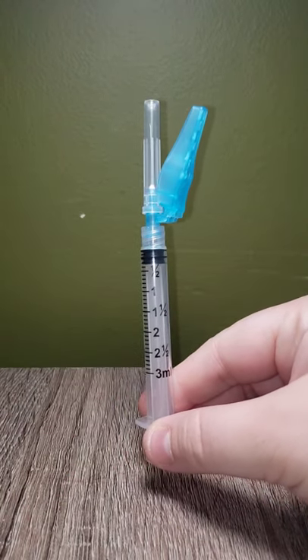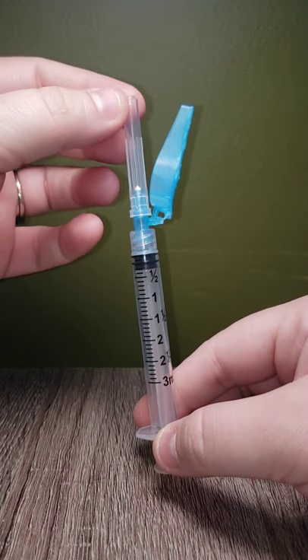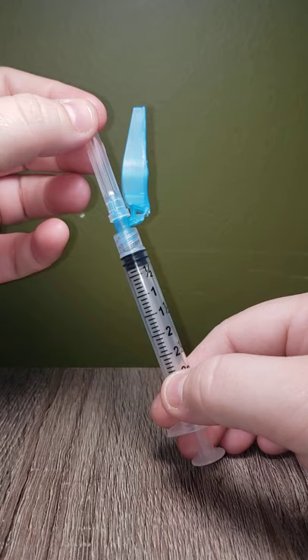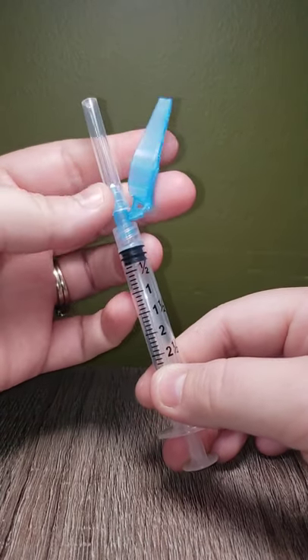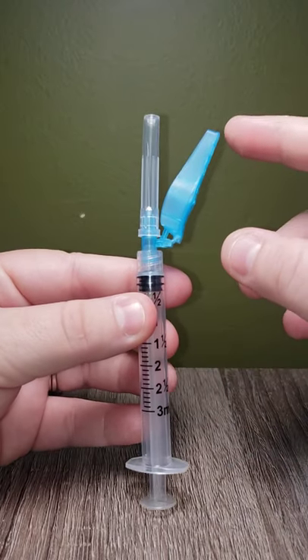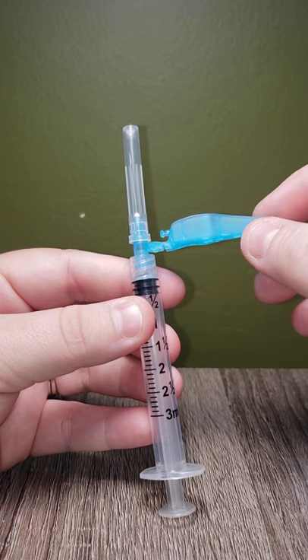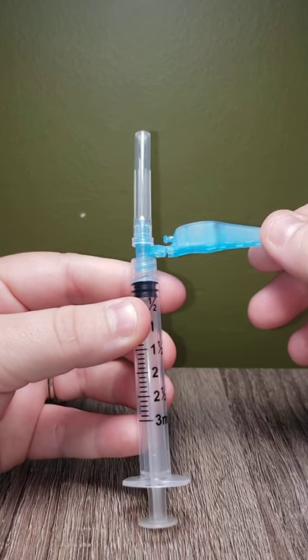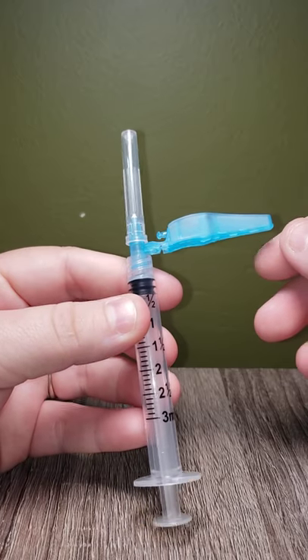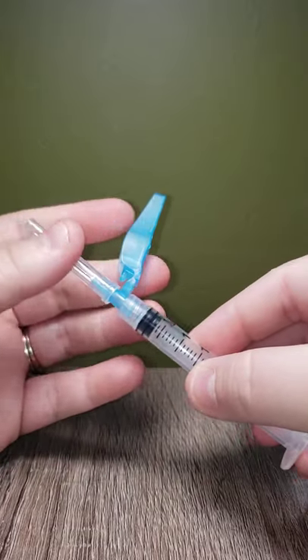Got a 3ml syringe here. First part: the needle cap. Don't want to lose this — hold on to those when you're drawing medications. You never know if you have to recap something. This little blue piece that's hanging off, it can be moved to facilitate injection into a patient, depending on medication and location. You can move it wherever you like. It's pretty flexible.